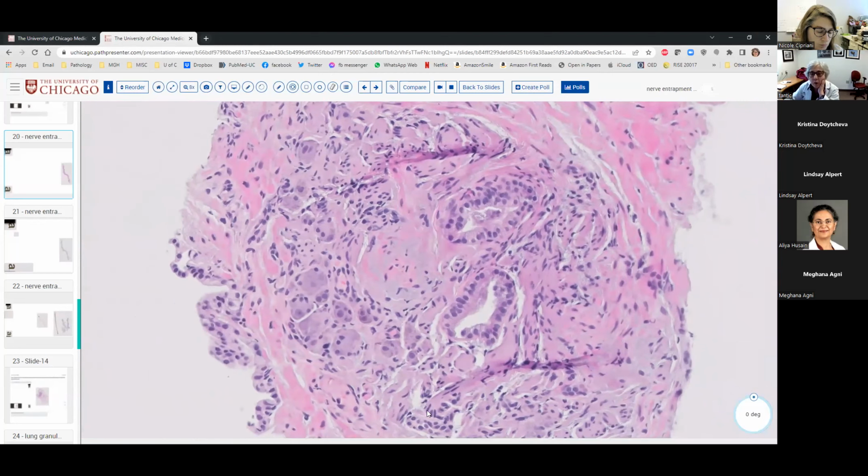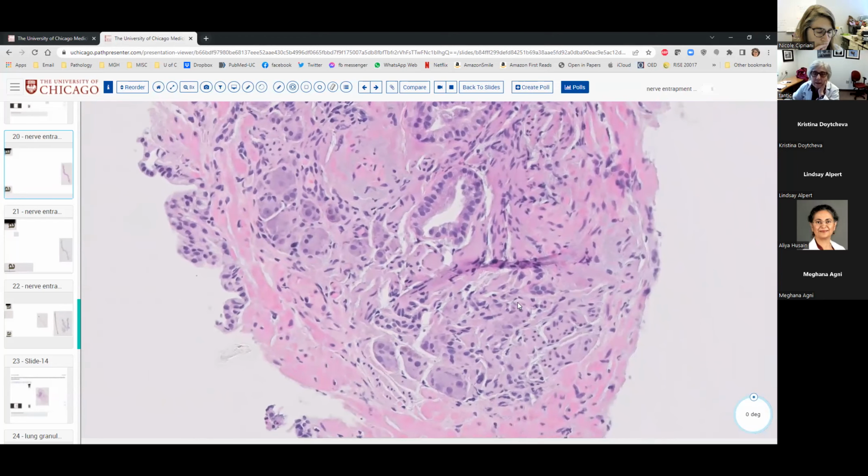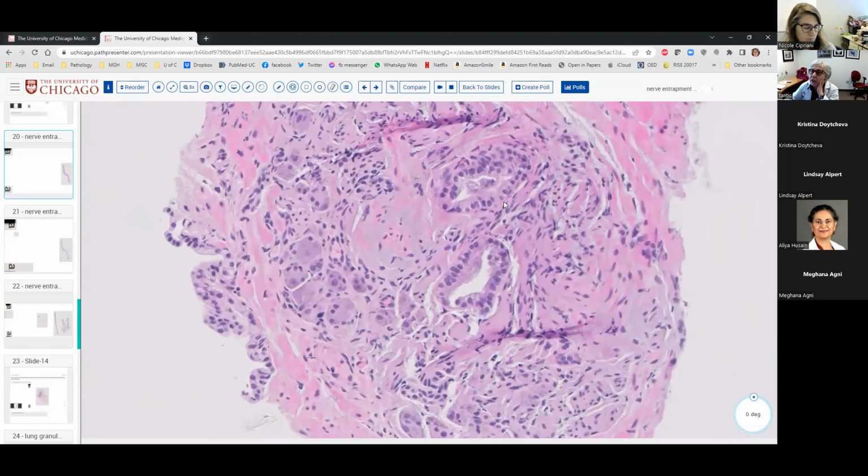Now, the structure, obviously, is a ganglion, and the glands are embedded within. Of course, the teaching is that when you have glands within the ganglion or next to it, that immediately means something is malignant. However, in this case, you need to judge morphology rather than the location.